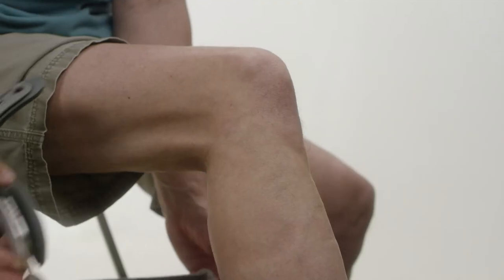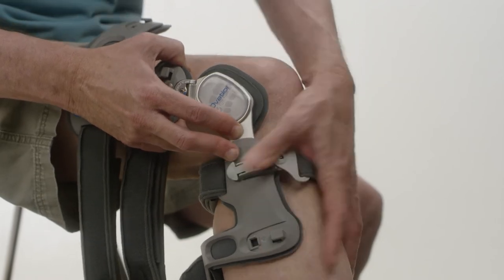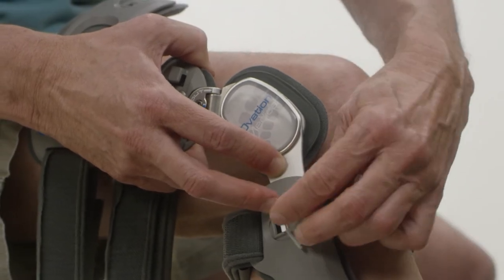Step 2: Position brace. Position brace by sitting on a stable surface with knee bent at approximately 45 degrees. Align the center of the hinge to sit just above the patella, as shown.